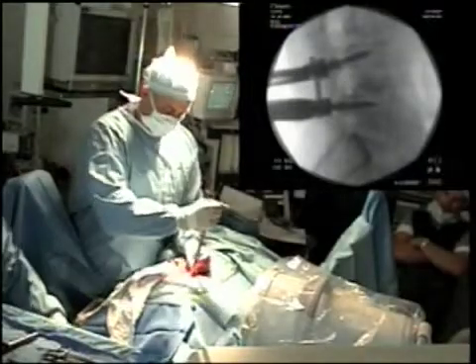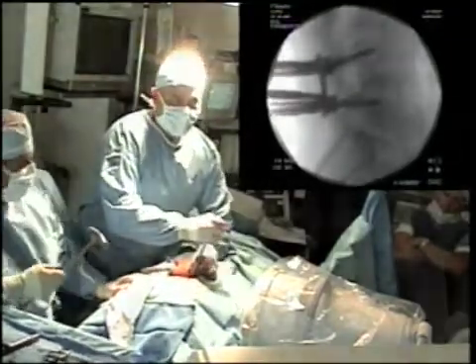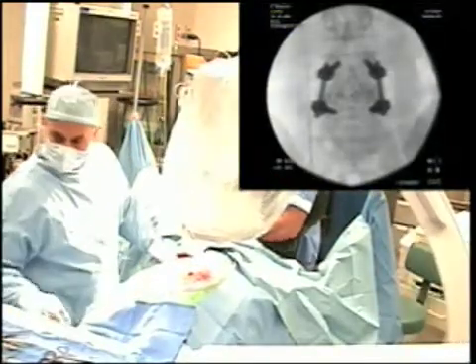A rod is then placed into the screw heads, providing posterior stability and support to the fusion mass. This procedure is carried out bilaterally.